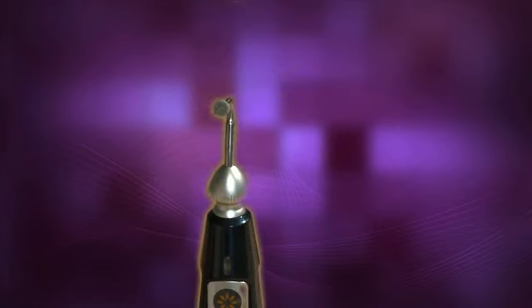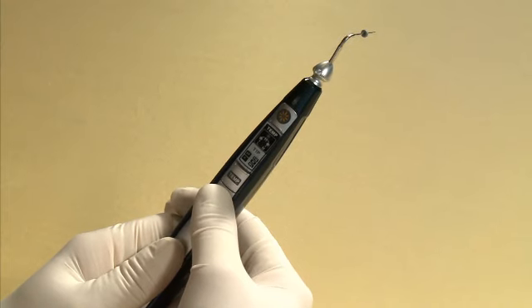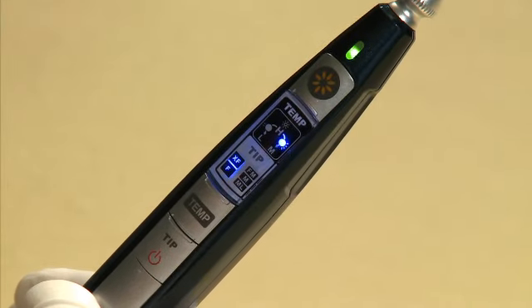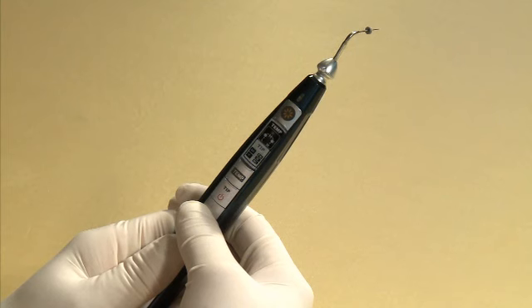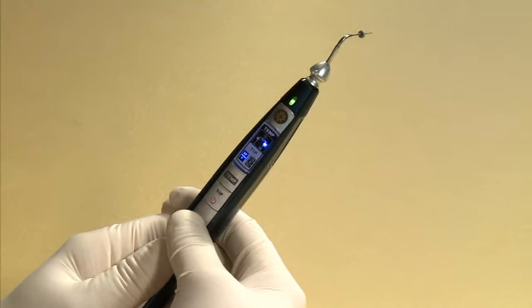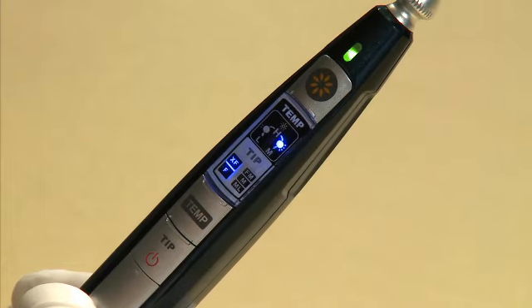The pen tip can be adjusted into six different positions. After inserting the pen tip, press and hold the power button for one second to turn on the device. The default setting for tip size is XF/F, which is indicated by the XF/F indicator on the handpiece.